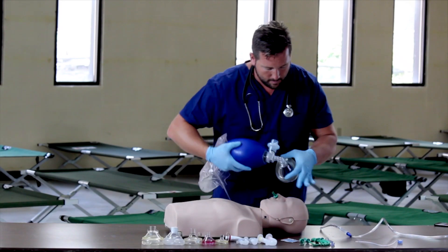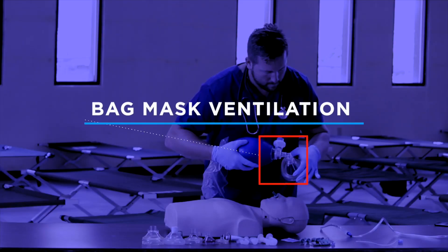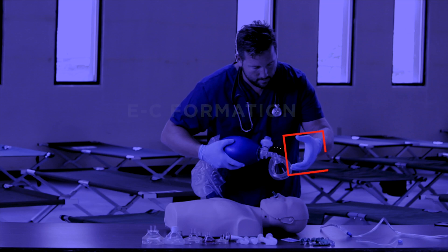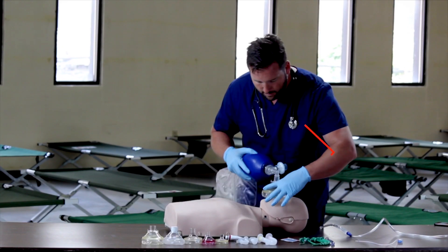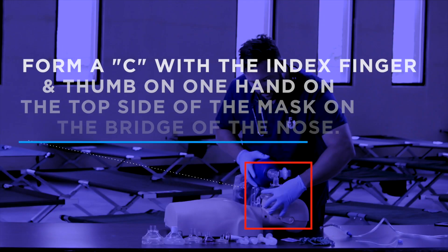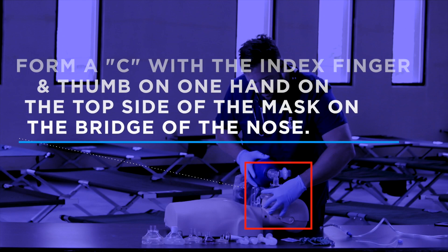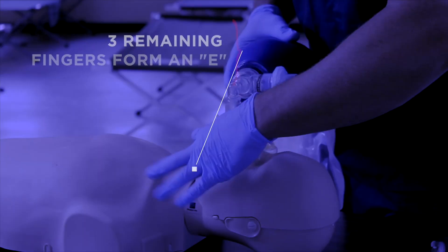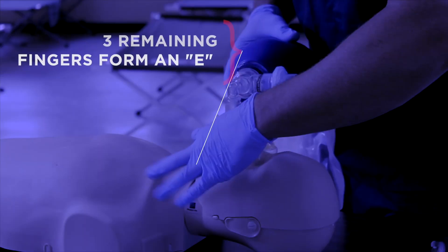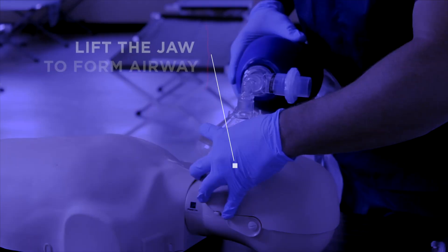Now that we have our airway adjunct in place, we move to bag mask ventilation. To properly use the bag mask, use the EC formation with your hands. Form a C with the index finger and thumb on one hand on the top side of the mask on the bridge of the nose — this securely applies the mask to the face. The three remaining fingers form an E, and use these fingers to lift the jaw, forming the airway.